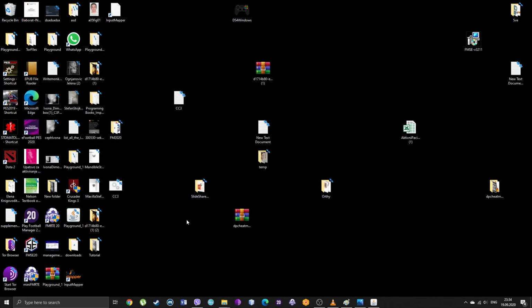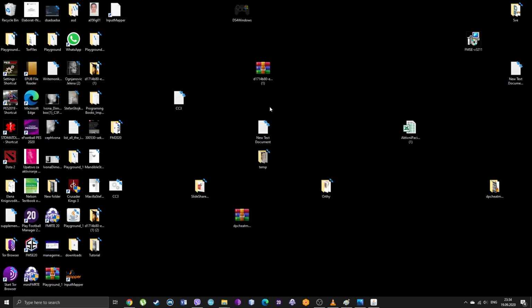Now, one more thing you should know: some of you have Macintosh. Nevertheless, I want you to know that you should have Java installed. It doesn't matter if you have Macintosh or Windows.